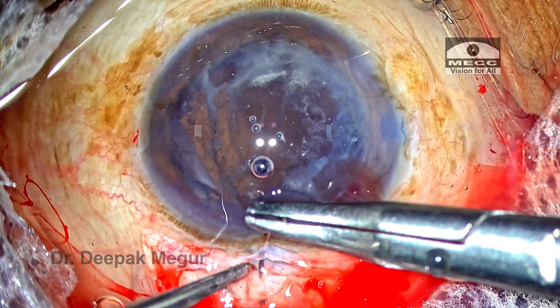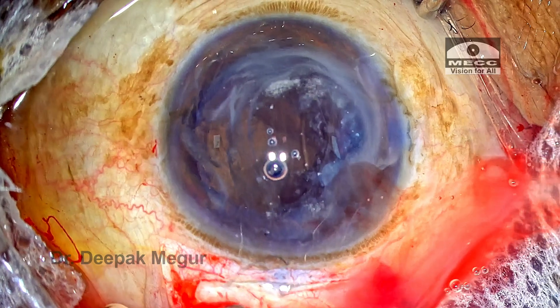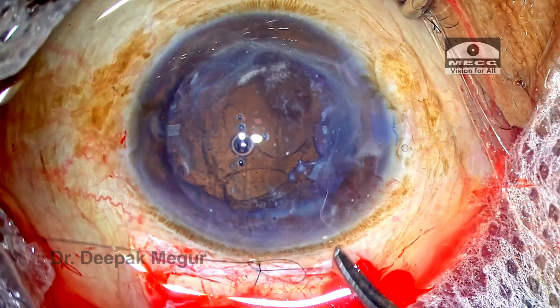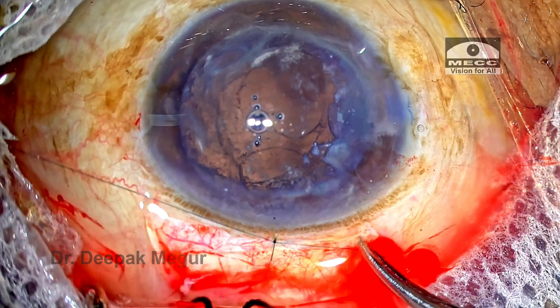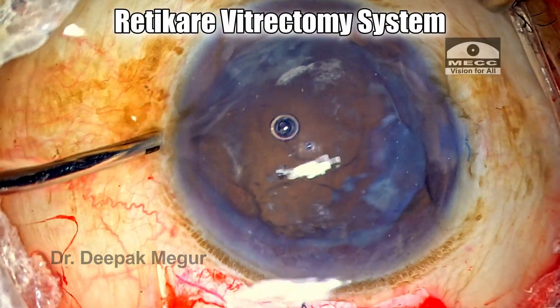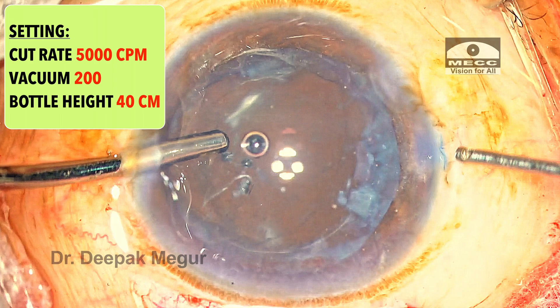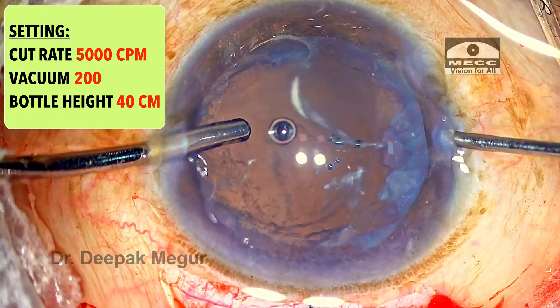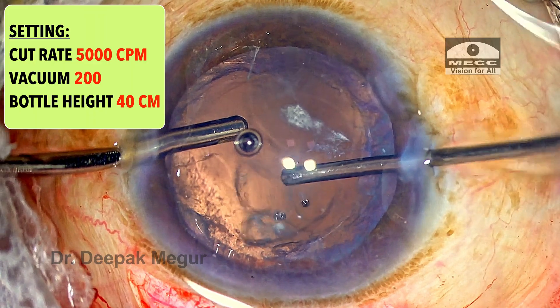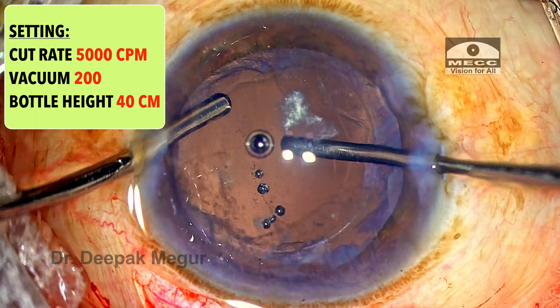The first good thing she does now is suturing the main wound. Remember, when doing anterior vitrectomy, the golden principle is to maintain a closed chamber during bimanual anterior vitrectomy — using the vitrectomy cutter and the irrigation probe through the two side ports, avoiding any leakage from the main incision. She's going to use the Reticare vitrectomy unit, which is Venturi-based. The infusion is from the left hand, the bottle is decreased to about 40 cm, the cut rate is set to 5,000 cuts per minute, and the vacuum to 200 — a relatively low vacuum with a high cut rate.